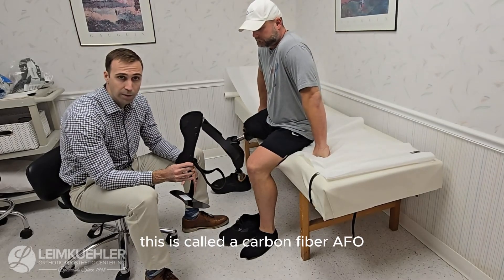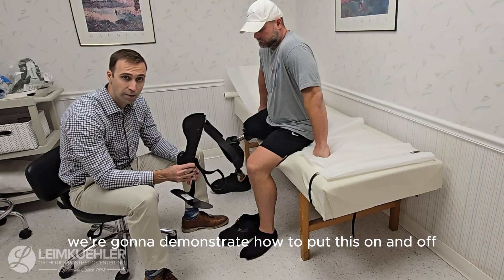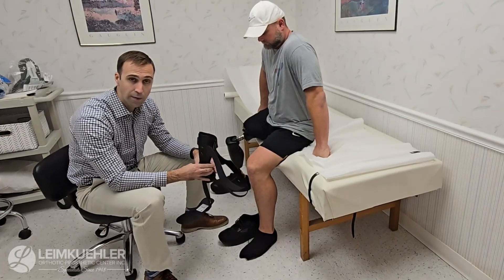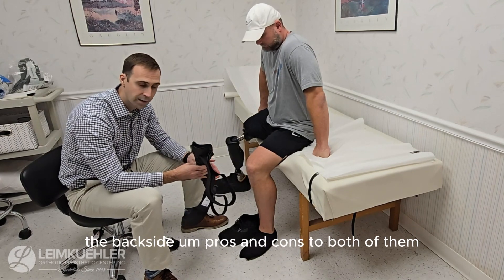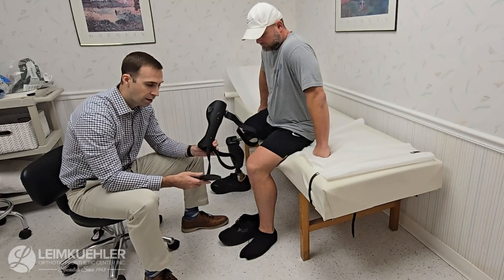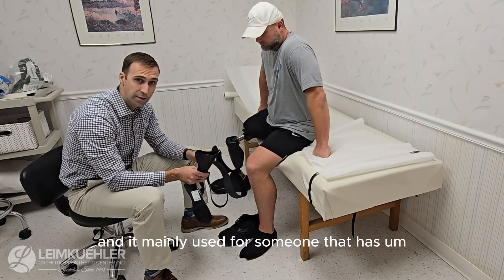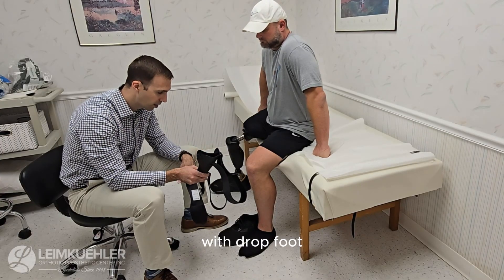This is called a carbon fiber AFO. We're going to demonstrate how to put this on and off correctly. This is an anterior — what that means is the front — this goes on the front of your leg. There are two different kinds that we normally use: one goes on the front and one goes on the posterior, or the back side. Pros and cons to both. The nice thing with the carbon is they're very lightweight, fit into a shoe very easily, and they're mainly used for someone that has drop foot or a little bit of knee instability with drop foot.